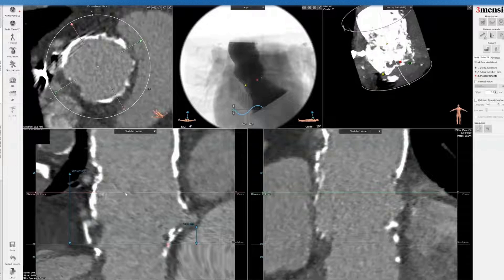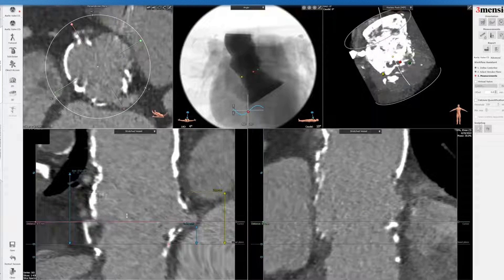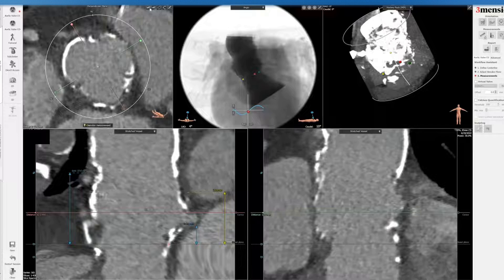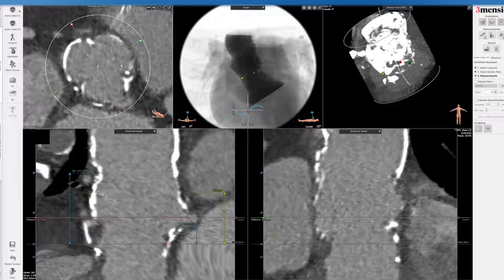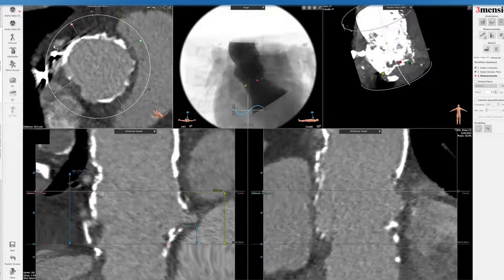What we're looking at next is the left sinus. Then I'm going to look at the sinus of Valsalva — try to get the maximal dimension. Sometimes it's not half of the STJ, so you have to go from commissure to commissure and then the commissure to the opposite. These are often quite rotated, as you can imagine. This is the right sinus, this will be the left sinus. For the non-sinus, you can check — you can see the left main coming off. The right is sometimes a little aberrant with a slightly different takeoff, and there's a little bit of artifact over here.